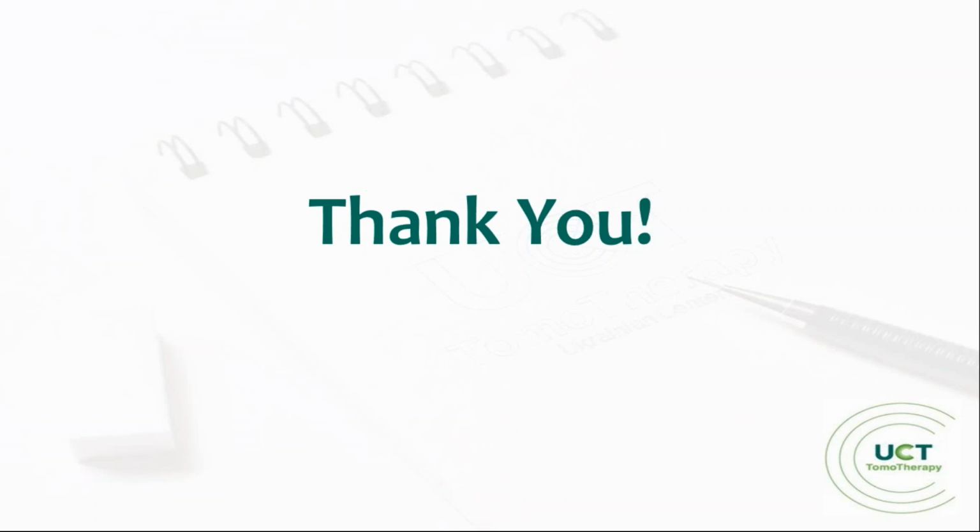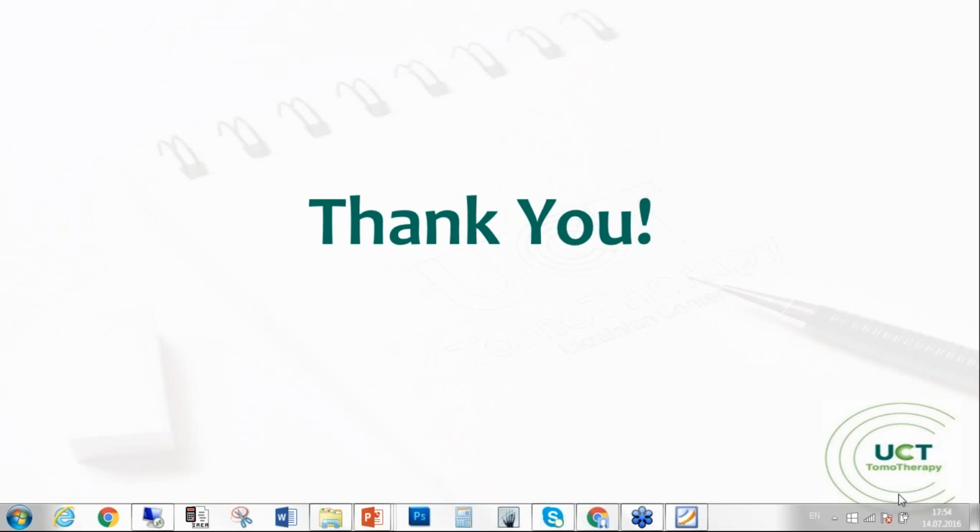This is why such webinars can be very useful for planners. The way Dimitro divided the organs at risk, some completely blocked, some with directional block, and how he uses different optimization objectives. So thank you very much, Dimitro, for this presentation.